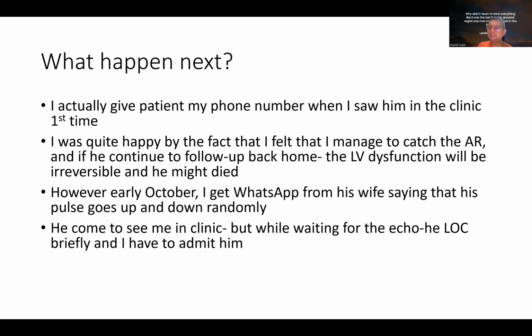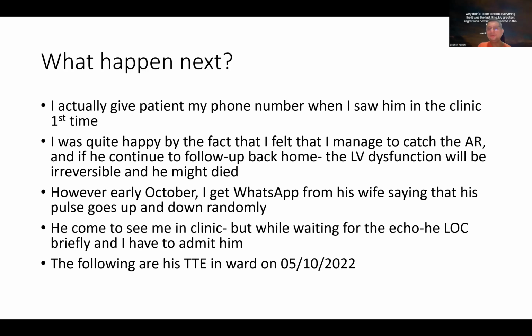So he came to see me in clinic. I asked him to repeat an echocardiogram. But while waiting for the echocardiogram, he developed a brief episode of loss of consciousness. So I had to admit him. The following was the transthoracic echocardiogram that was done in the ward when I saw him again.